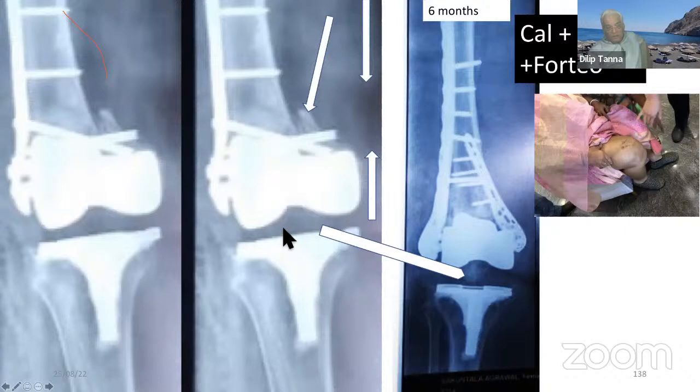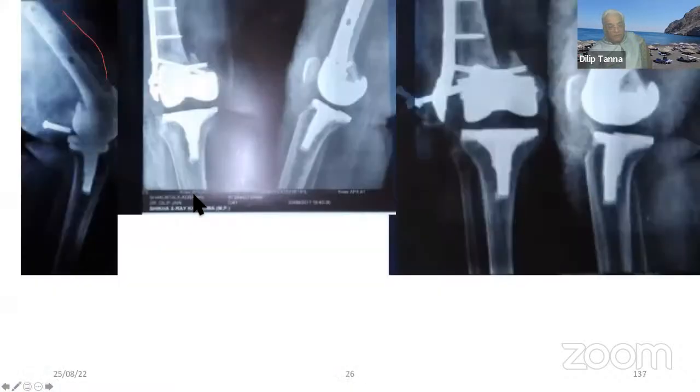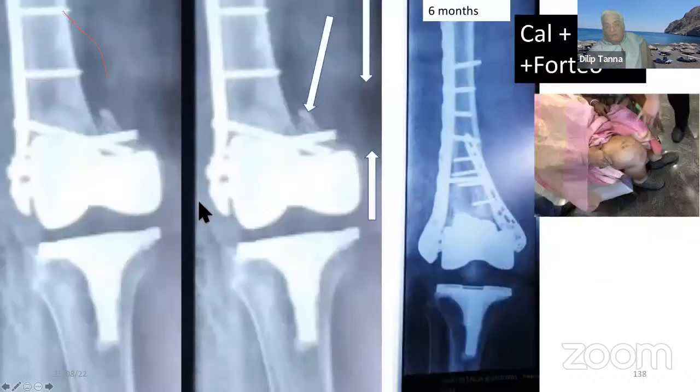So when I was doing it, I had expected, preoperatively, I felt there must not be much bone there. And as you can see here, she was also 75 or something, that age group. Probably twice I have done this, but not very often.